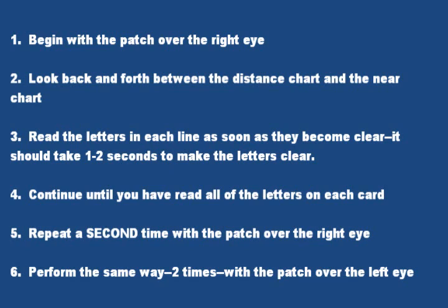4, continue until you have read all the letters on each card. 5, repeat a second time with the patch over the right eye. 6, perform the same way 2 times with the patch over the left eye.